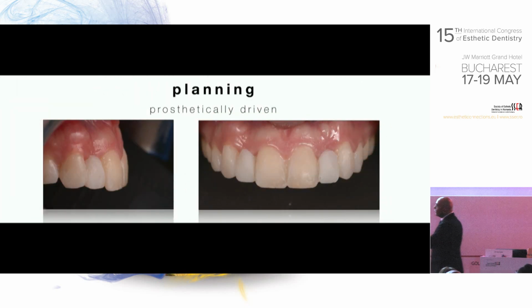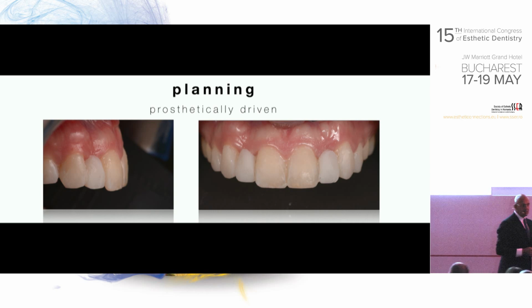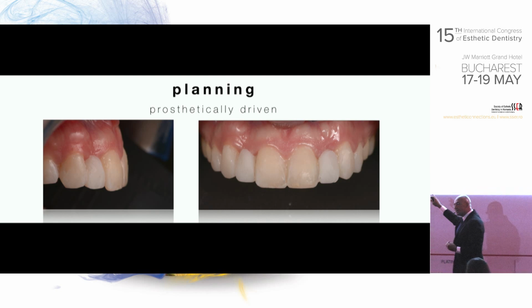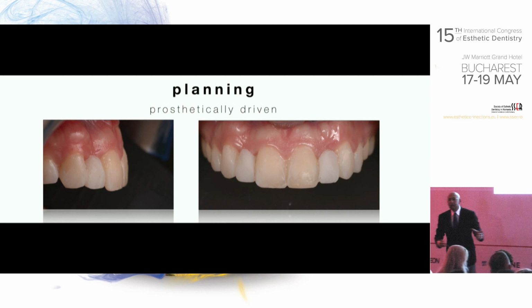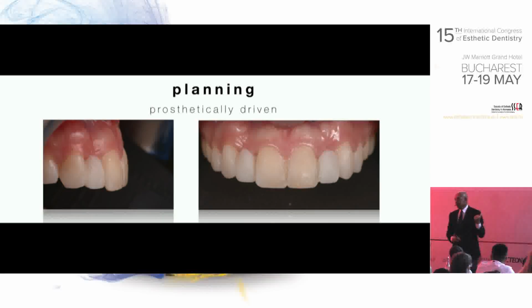Okay, so now I have something extremely solid in my hands, because what I achieved here is the part that we all agree with the patient that this is the aesthetic design both she and I want. So this is a great, great step, because without this, again, I'm repeating, I don't care what we do for all implant placement. If this will not be the final result, she'll always be unhappy.